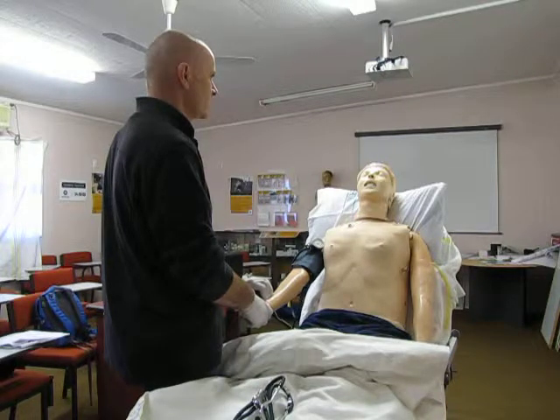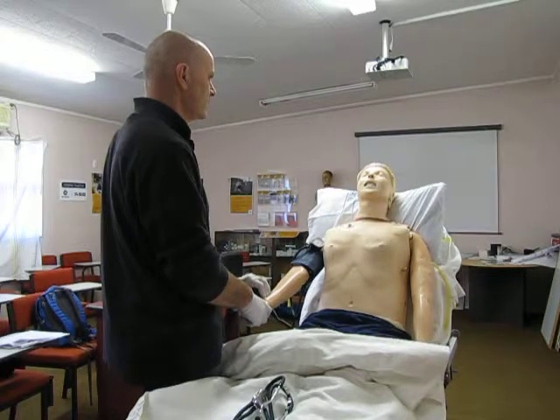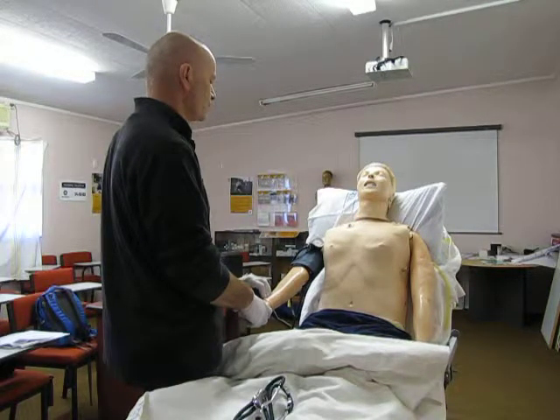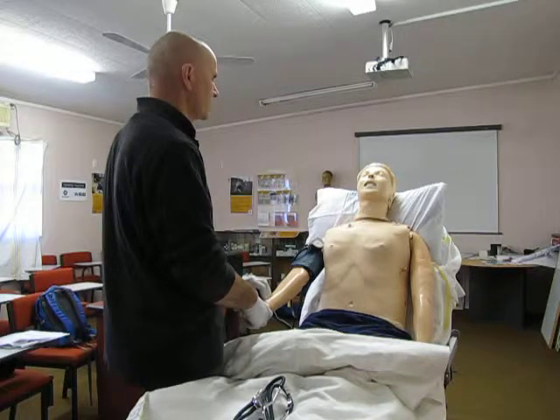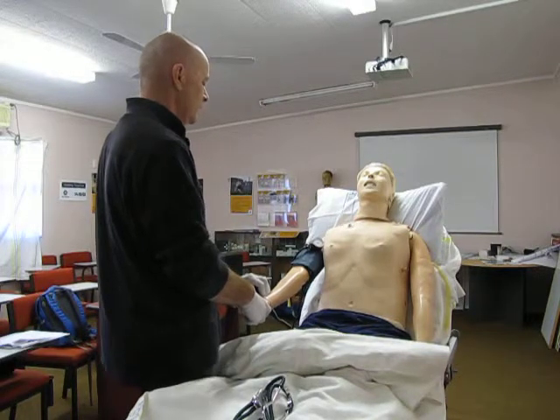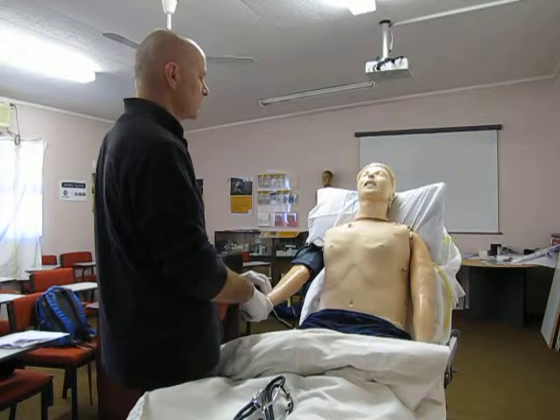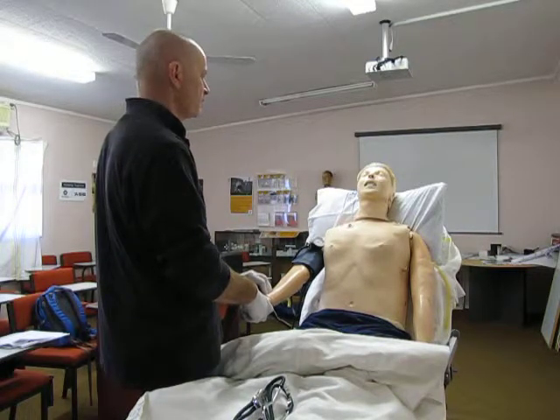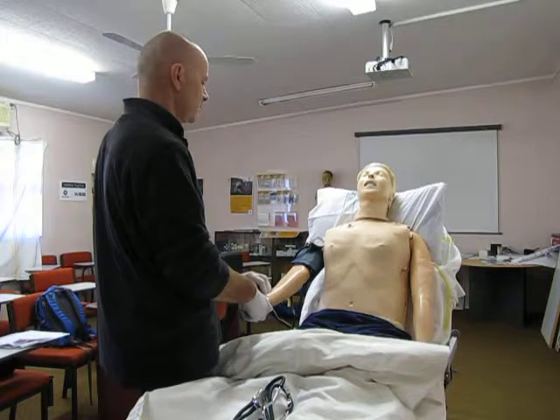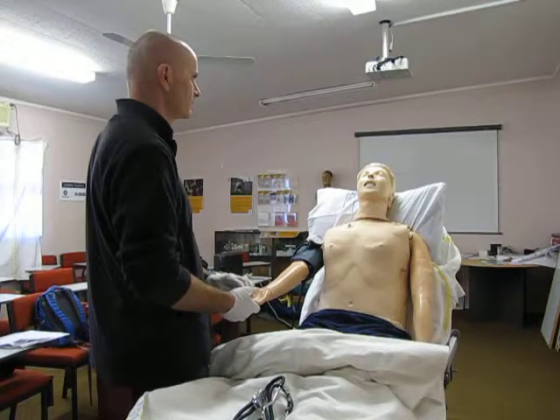At this point, we would also look at ascertaining a blood pressure. This is telling us how hard the heart is working, whether the patient is suffering from any arteriosclerosis if they have high blood pressure, or if there's something else mechanically that's not quite right. As we're touching the patient at this point and taking their radial pulse, we can also ascertain their skin temperature, whether they feel clammy, and looking at their peripheral perfusion as well, so the colour of the hands, how quick their cap refill is.